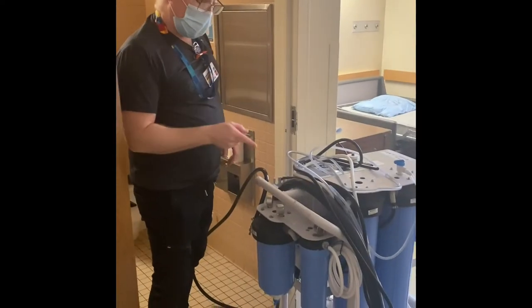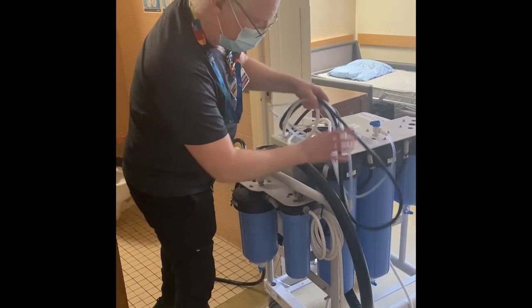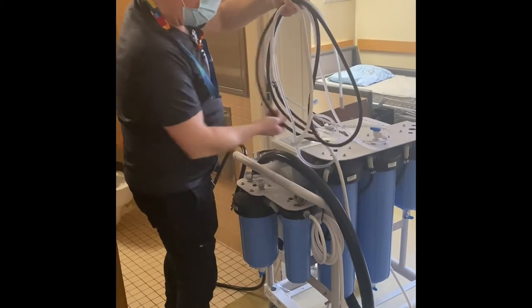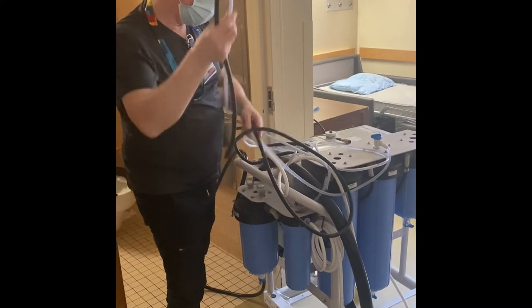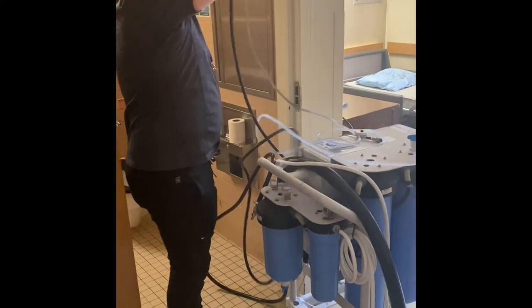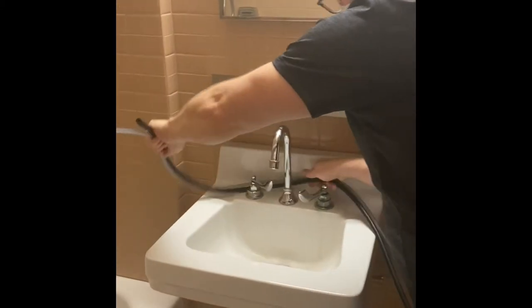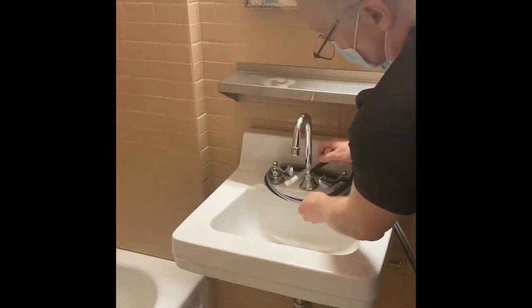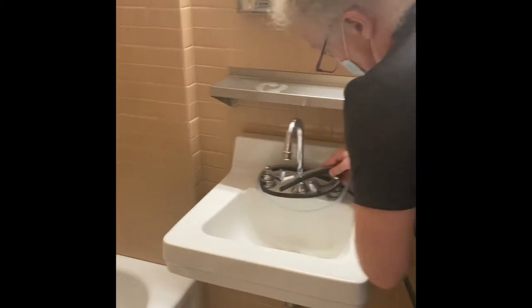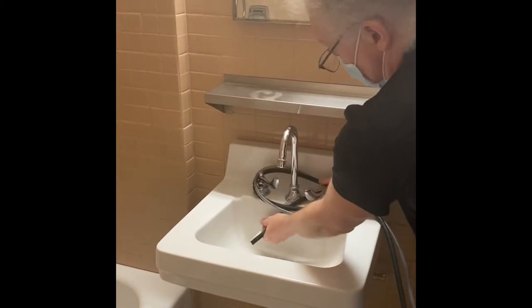First we're going to connect the drainage hoses. You have two — the narrow black one and the clear suction hose. They go into the sink. You should have enough length to wrap them around the faucet so they're held in place.